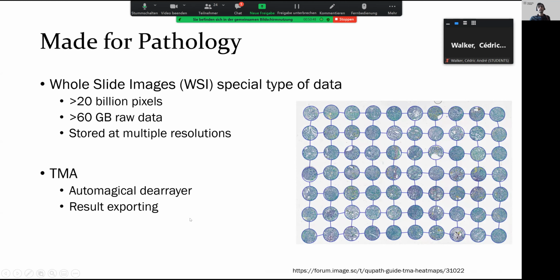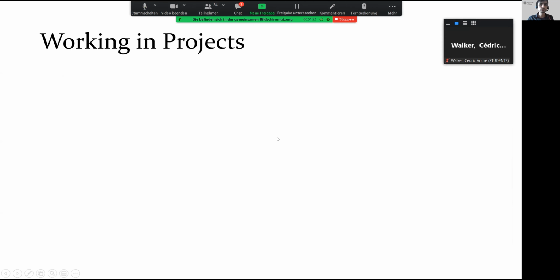Besides, tissue microarrays are very important in our research practice, and in Qupath, one can easily handle these TMA images and also analyze them, export the data from the TMA tissue, and it's very convenient. Otherwise, annotating or evaluating those TMAs manually, including this data, again the data stored measurements in Qupath, and then afterwards getting one file containing everything.